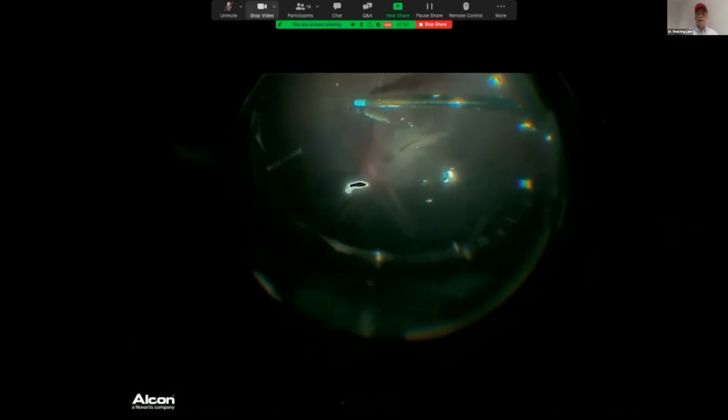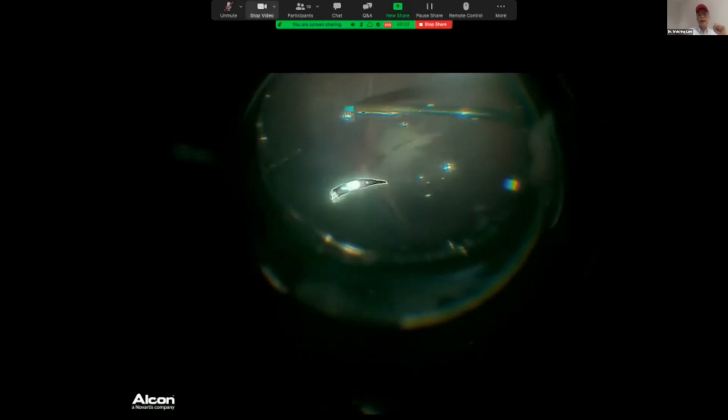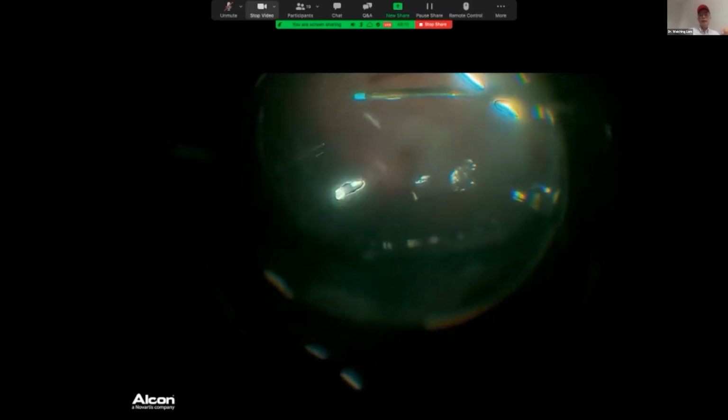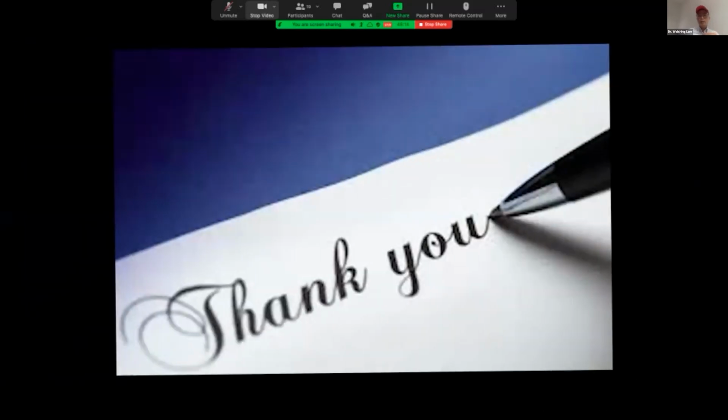Now, there's often a question of where you're going to drain. You drain through the macular hole, or you drain in another location. In this case, I decided to drain in an extrafoveal location. So you can see I pick a spot and create a retinotomy in an area outside the macular hole. My rationale is if you drain through the macular hole, often the rush of the subretinal fluid or the manipulation of the soft tip backflush can enlarge the macular hole. That could potentially either damage the recovery of vision or make the macular hole fail to close. So creating a small hole in an extrafoveal location allowed me to flatten the detachment without manipulating the macular hole.